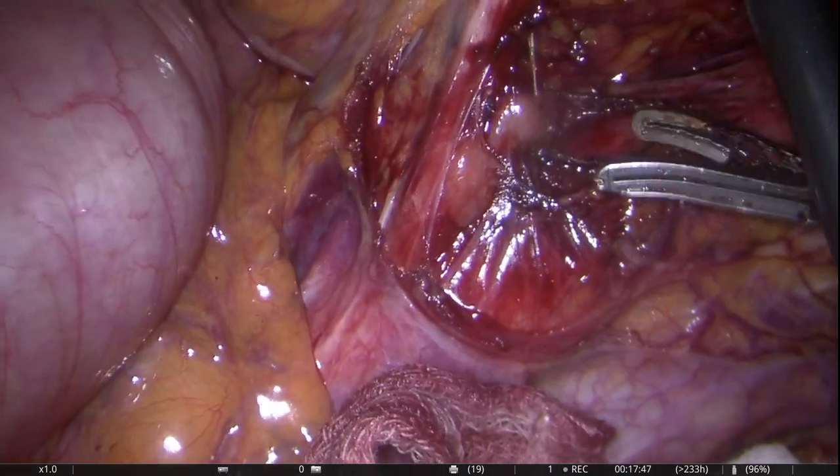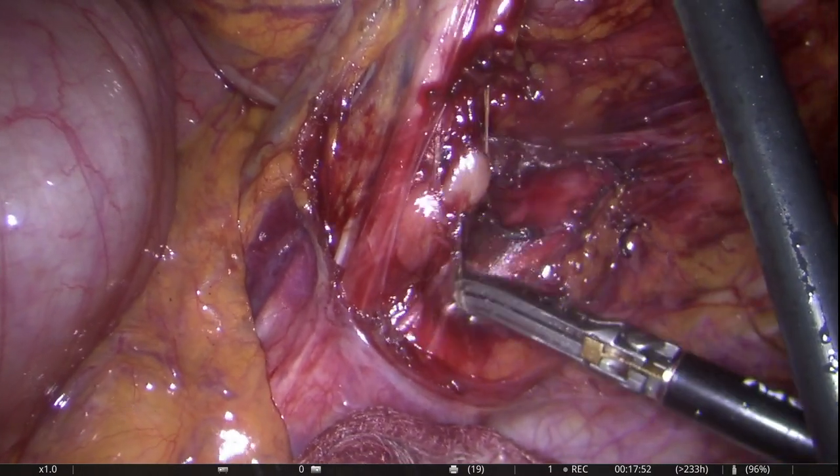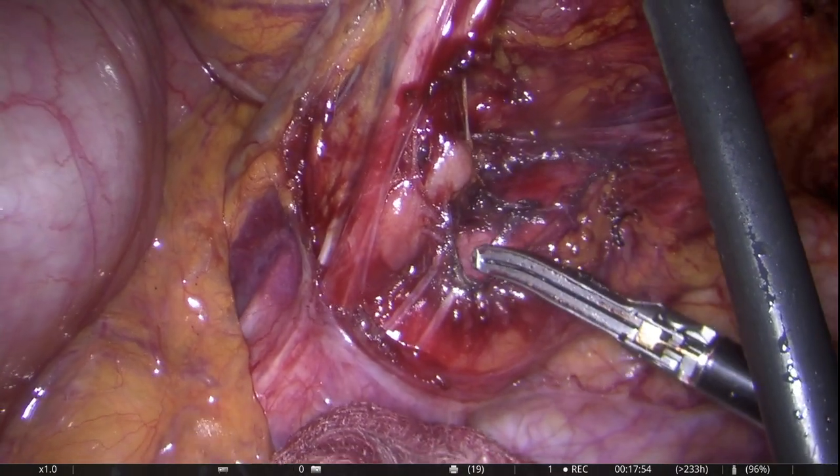The layer over the aorta is being opened up to achieve a high tie and inclusion of the lymph nodes in the specimen.